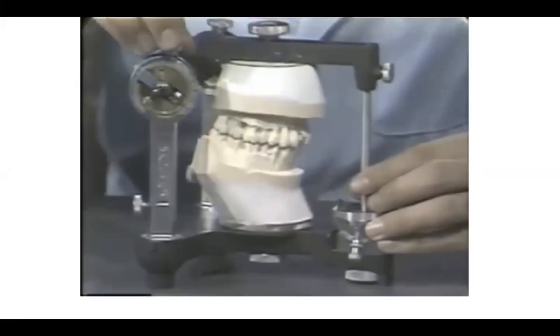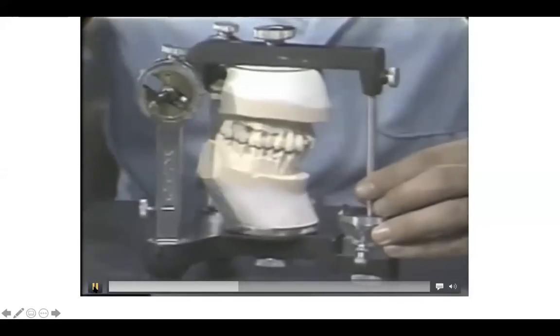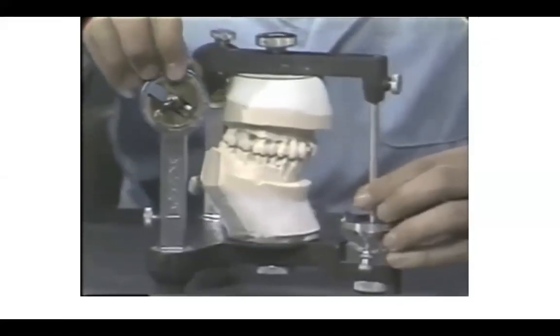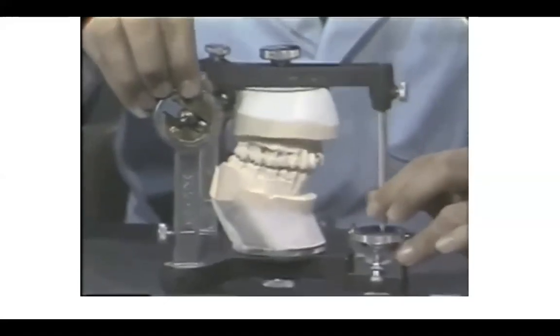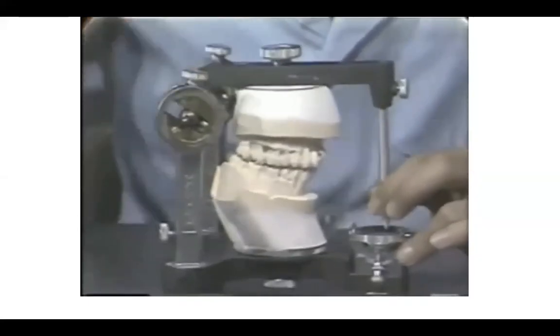And this condylar element and the condylar guidance is going to be different in Arcon and non-Arcon articulators, which I'll explain to you further, inshallah. Condylar element and the basic movements of the articulator. We've already illustrated one, the opening and closing movement about a transverse or horizontal hinge axis.